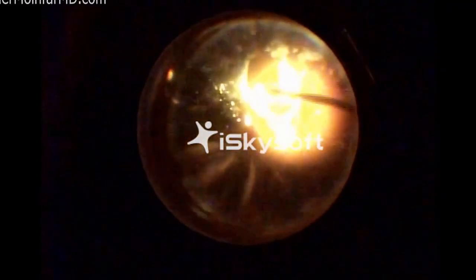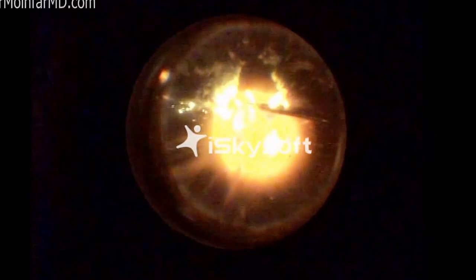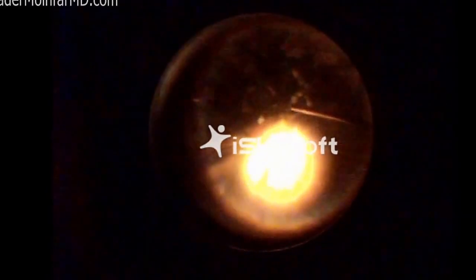Now sometimes if the surgery is particularly long, or there's a lot of manipulation of the eye during surgery, then the incision into the eye, also called a sclerotomy, may become a little bit more gaping than we would like it to be, and a simple absorbable suture can be passed. There are different types of absorbable suture, but typically they absorb over the course of about 10 to 12 days. So patients may sometimes feel like there's a little scratchy or foreign body feeling from the suture, but again, it absorbs on its own. But in most cases, sutures are not needed.